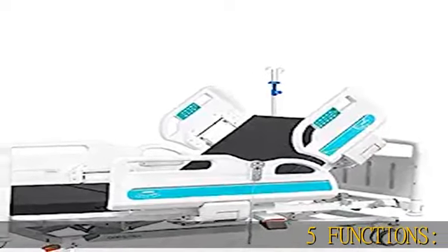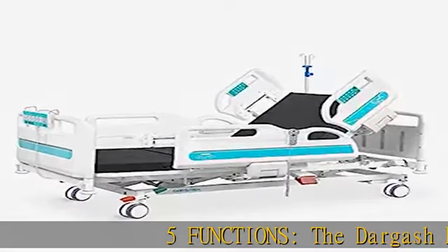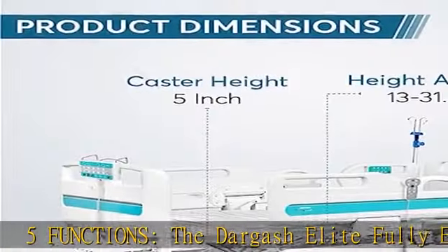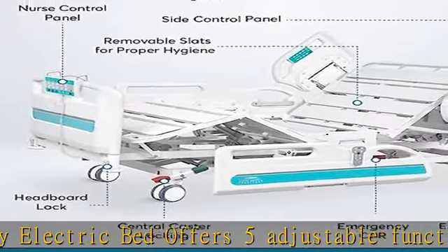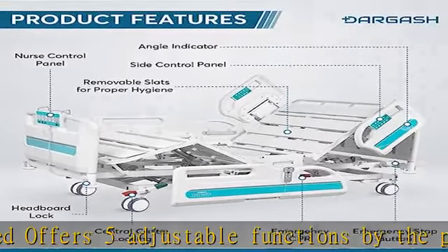5 Functions. The Dargash Elite Fully Electric Bed offers 5 adjustable functions by the press of a button. Elevation of the head and back from 0 to 85 degrees, and knee rest adjustment from 0 to 45 degrees.